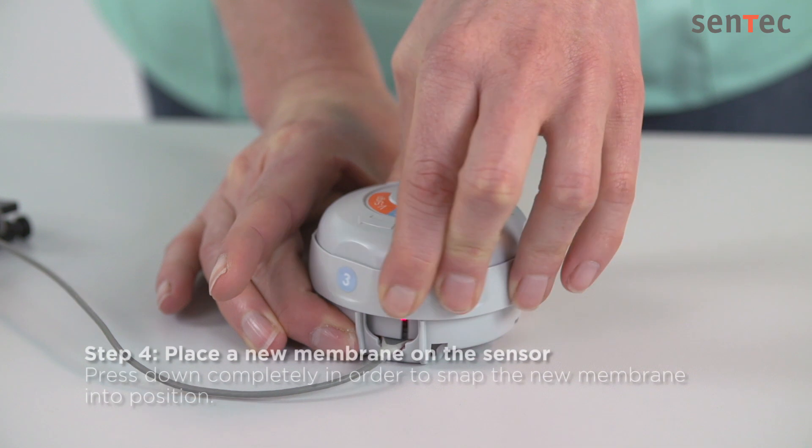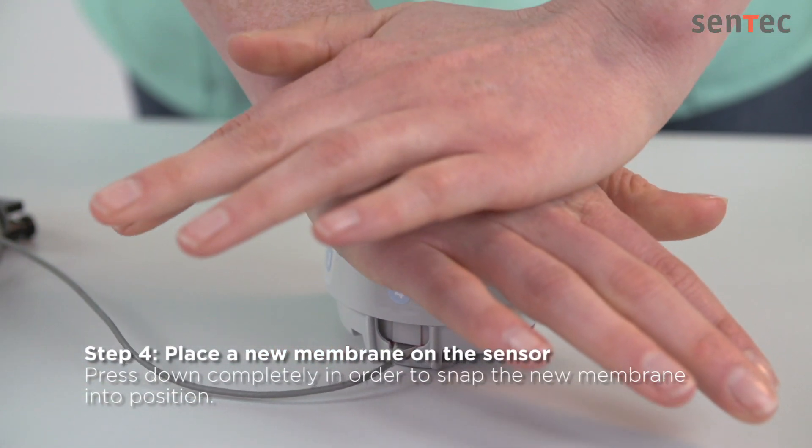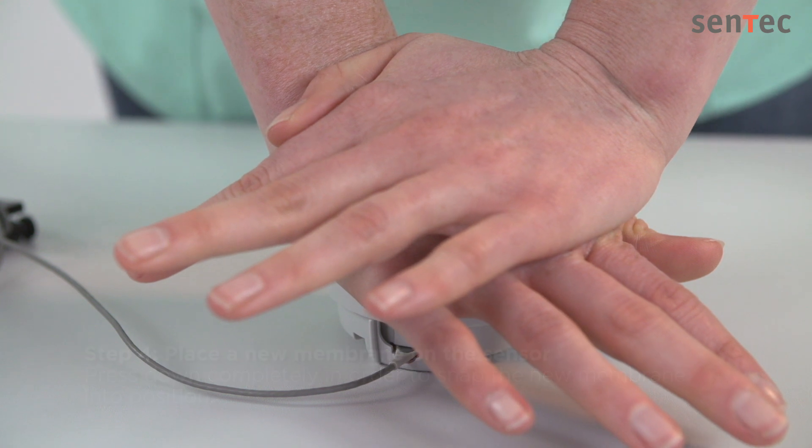When you reach Step 4, make sure to press down completely in order to snap the new membrane into position. This is easiest if you stand and press with both hands.